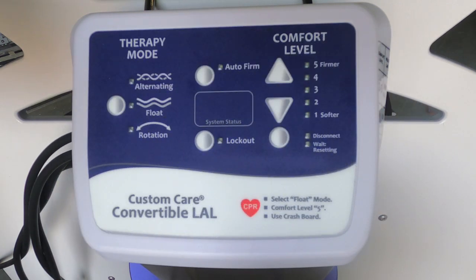This video is intended to acquaint you with the proper and safe use of the Span America Custom Care Convertible Low Air Loss System. This system is defined as a therapy surface which automatically adjusts a network of interconnected air cylinders and elasticized reservoirs to the appropriate level of support regardless of the weight or position of the patient. The maximum weight limit on this system is 500 pounds.